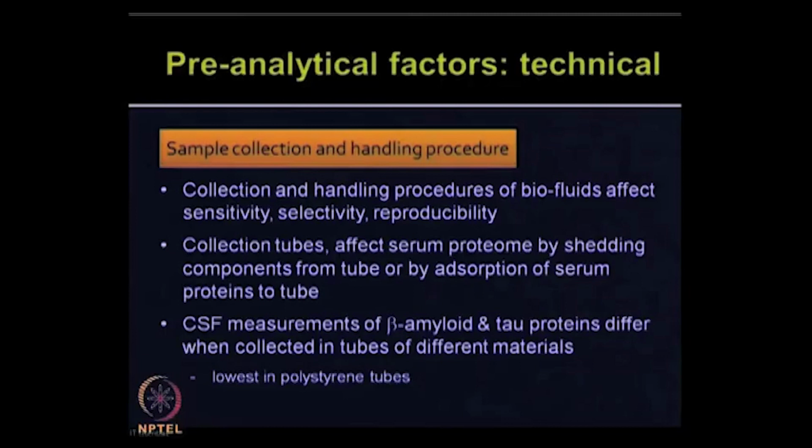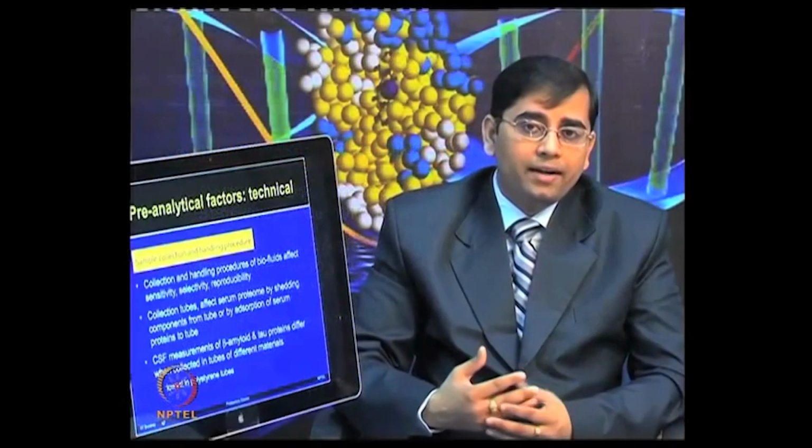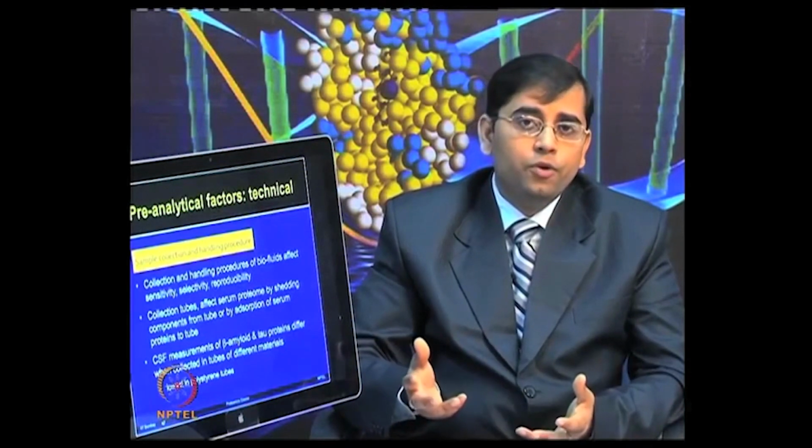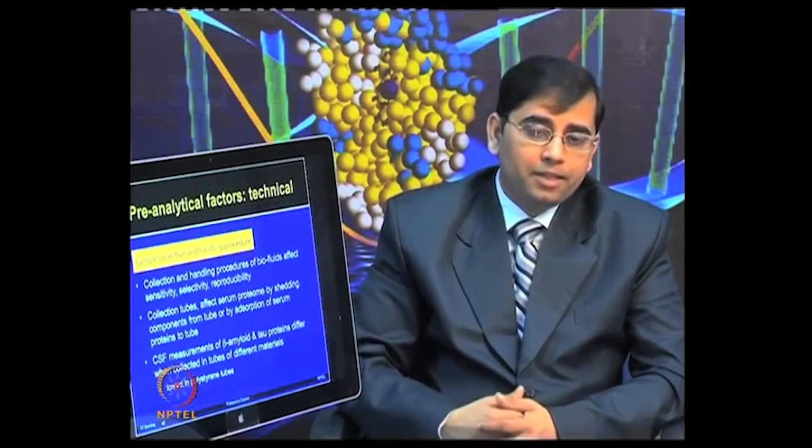So, with this discussion, it is very important to understand that one needs to avoid different types of sample tubes being used for collecting your biological samples.